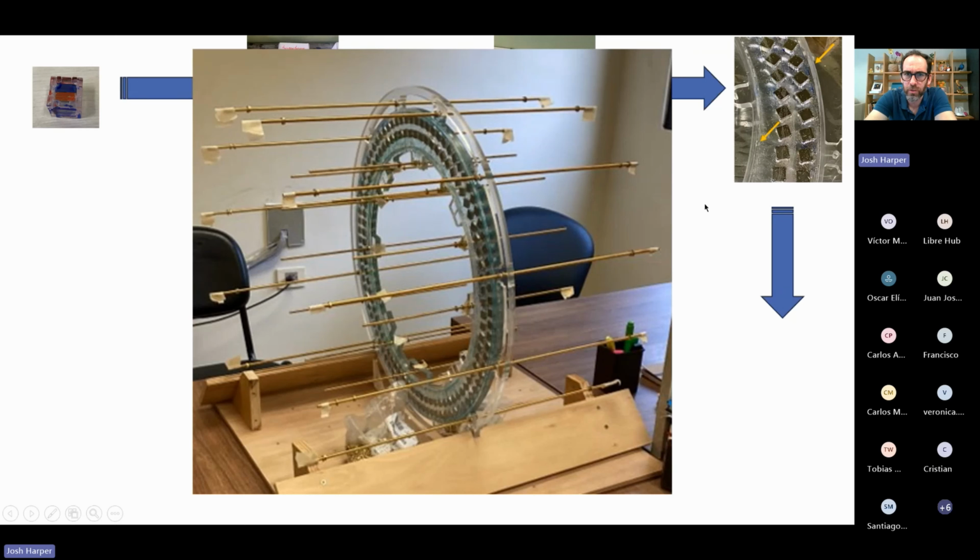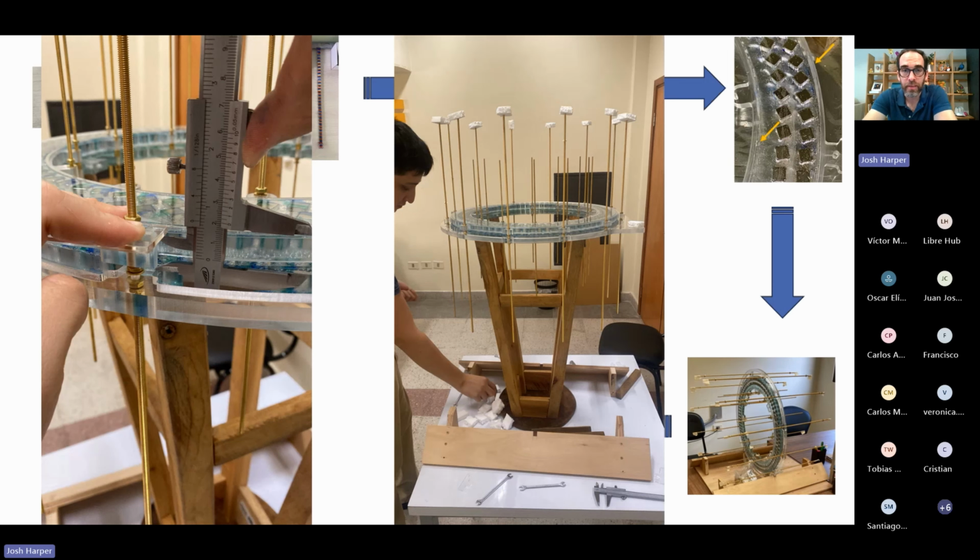After you have your rings glued, so this is the very center ring, we attach brass threaded rods all around. So there's 24 rods in total. And we attach those with brass washers and nuts and get them perfectly centered, because we'll be filling rings both to the right and to the left. And then we went inverted with our system so that we could put the rings on more easily to begin with. You slide rings down these brass rods and you fix them with more washers and nuts.